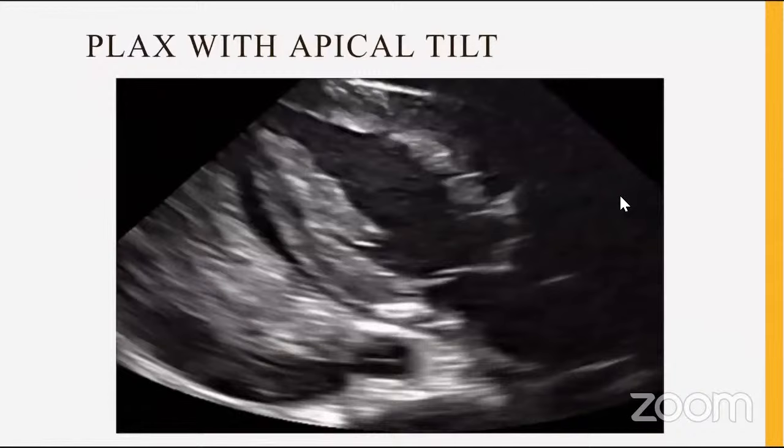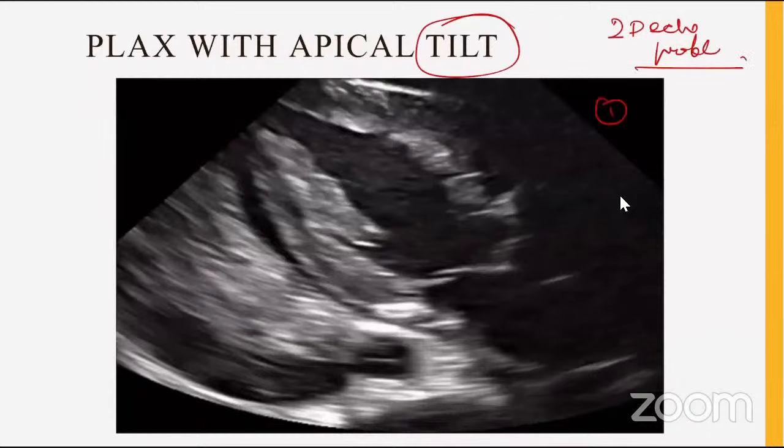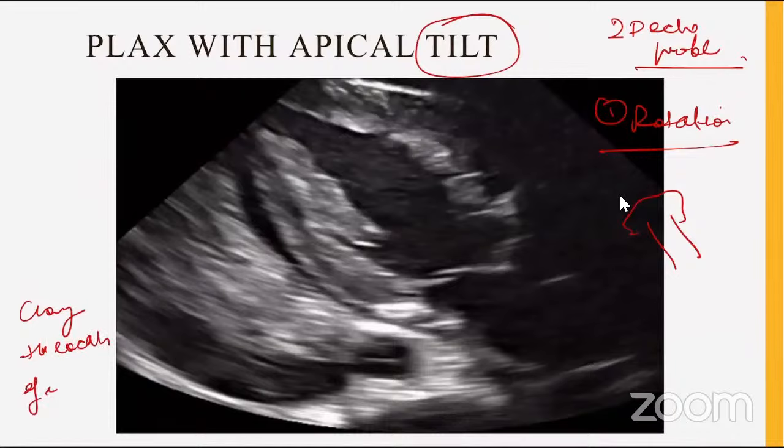Then we can also have this PLAX view with apical tilt. So this 2D echo probe, one movement in it is rotation. That is, the probe is placed here and we are moving the probe on its own axis just to change the location of the index mark. This movement is called rotation. Another movement that we have in the probe is tilting or angulation.